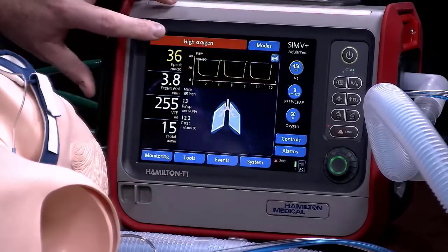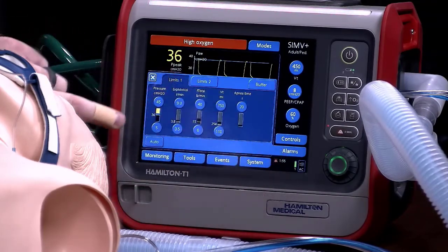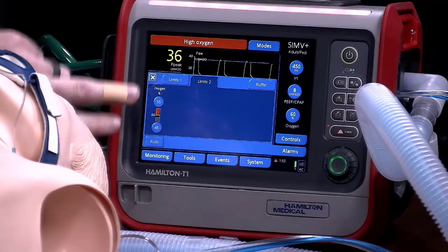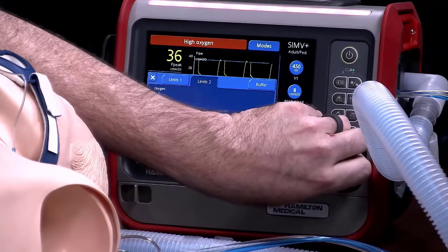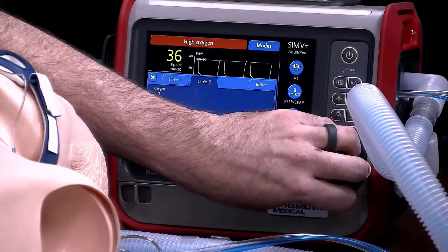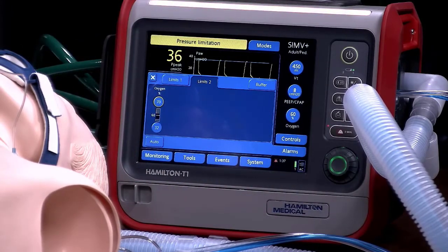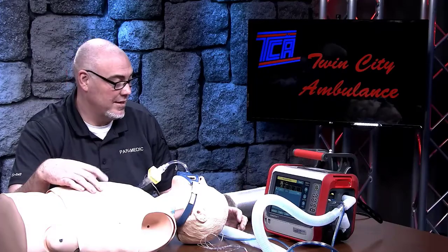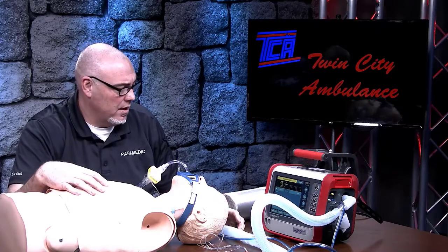We've silenced the high oxygen alarm. We can go to alarms again and limits, and we can change that as well. On limits two is your oxygen alarm — we can drop this, putting low oxygen down into the 30s and high oxygen up into the 70s. We can just change the thresholds for the alarm. If you have put the patient on the settings the hospital indicated and those settings are causing the vent to alarm, we can change the thresholds so we're not running into a problem with alarms going off the whole time on the way to the hospital.